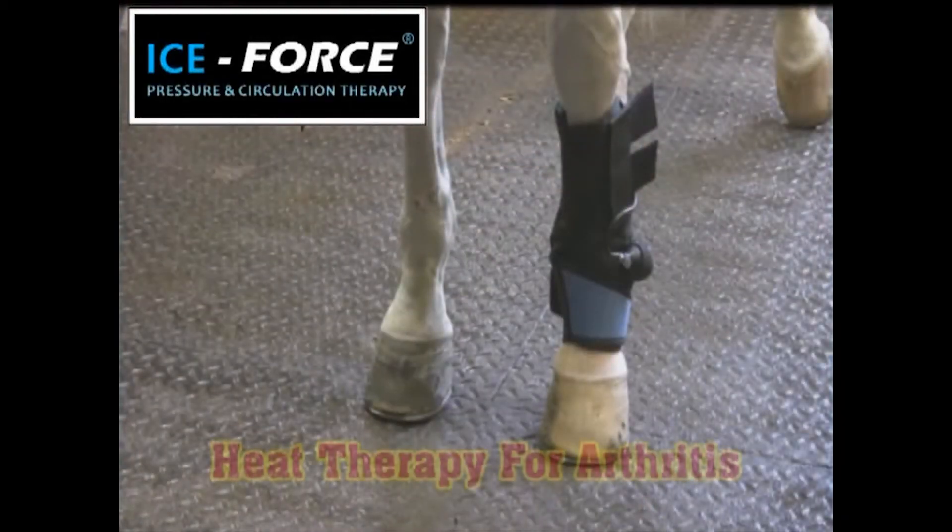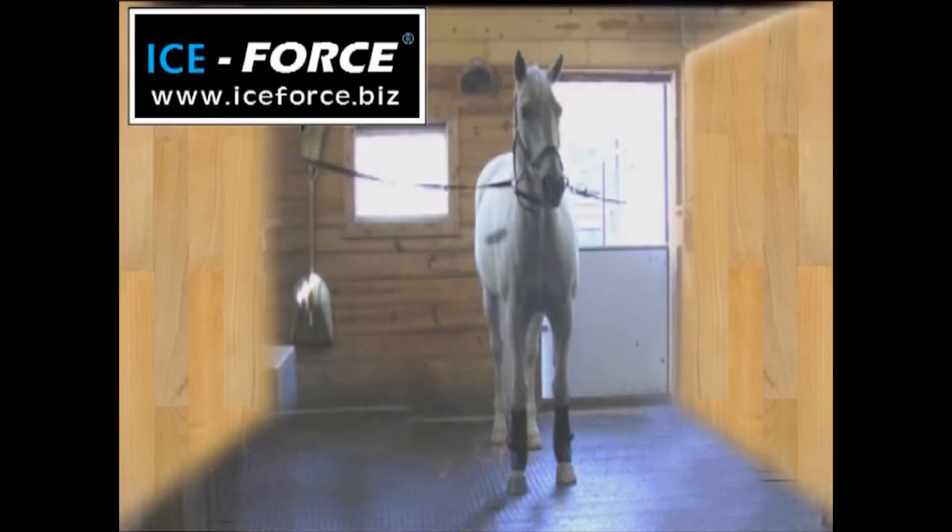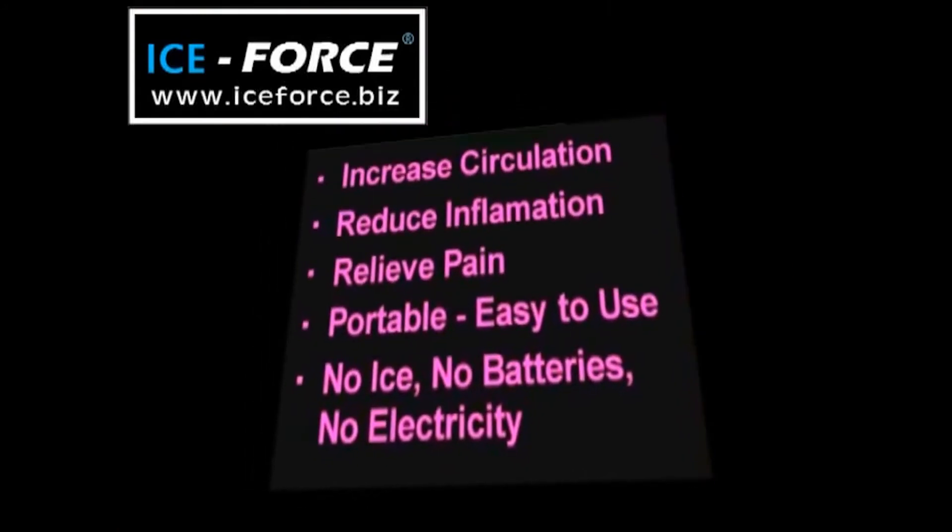By heating the packs in the microwave, Ice Force can be used for effective heat therapy for horses suffering from joint pain or arthritis. You can get similar benefits of much higher-priced systems with a simple pair of Ice Force Boots.